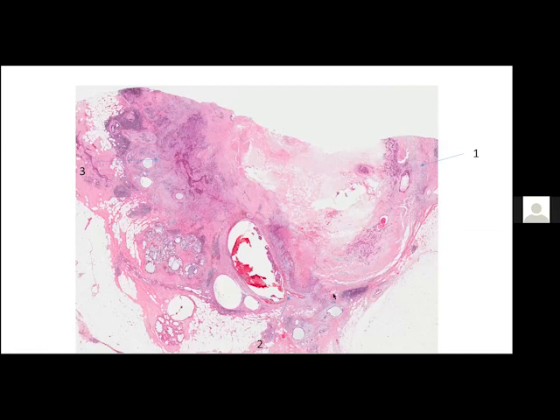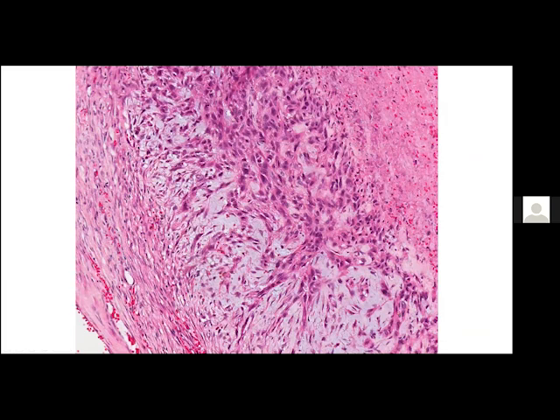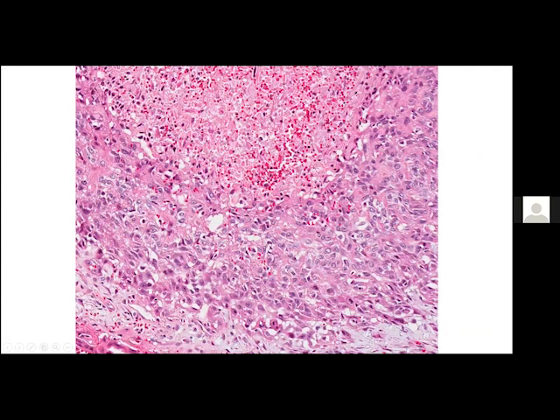This was the opposite side of this transected tumor. And I have 3 little areas that I wanted to show you around the edge. In this area, we have almost a papilloma-like area, but then some infiltrative nests around desmoplastic stroma and an area of papillary ductal carcinoma in situ. At the bottom of this particular section, there's infiltrative, almost squamoid looking tumor with necrosis. Here's more of it here, where there's almost dyskeratotic cells seen here.